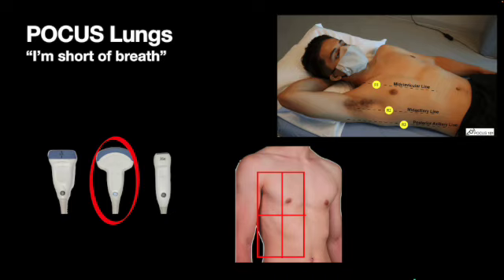Personally, I like this probe much more than any of the other ultrasound probes in looking at the lungs, because not only can I look for signs of wet lung, I can also look for lung sliding, and then I can look deeper, as this has a much wider field of view, and also the ultrasound beams go deeper. Their wavelengths are longer. If you had time to look at the physics lecture, you'd probably understand this a little better.